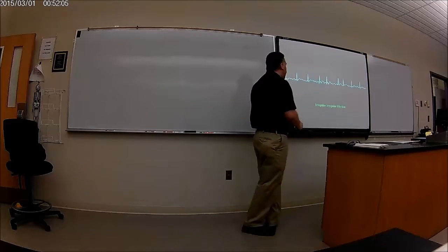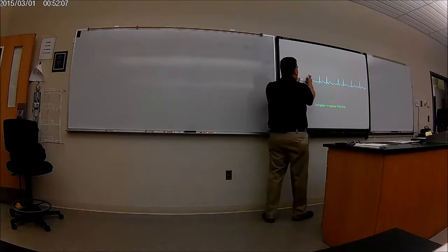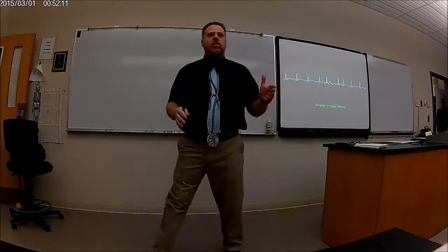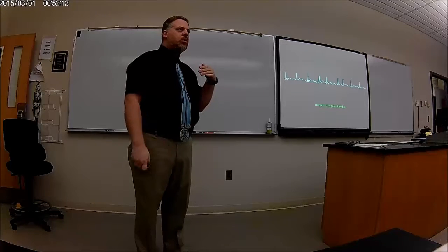This is irregular. The spacing in between the R intervals, there is no rhyme or reason. It doesn't make sense. There's no pattern there.